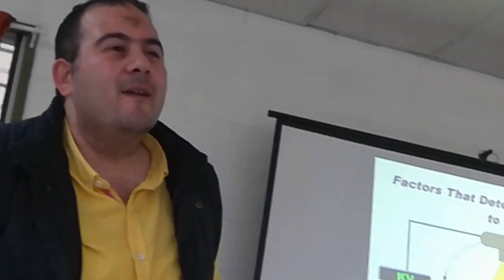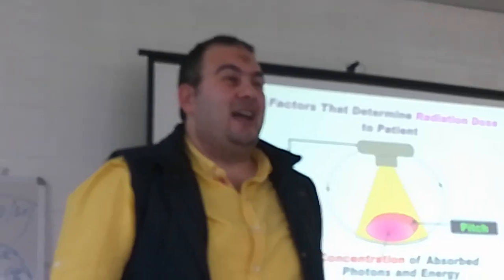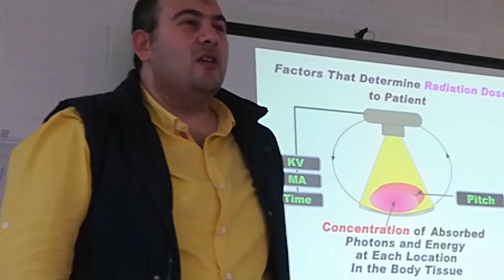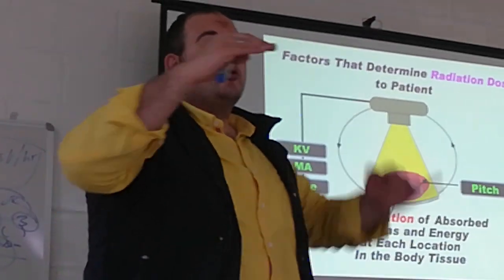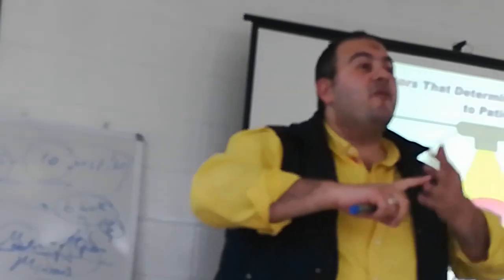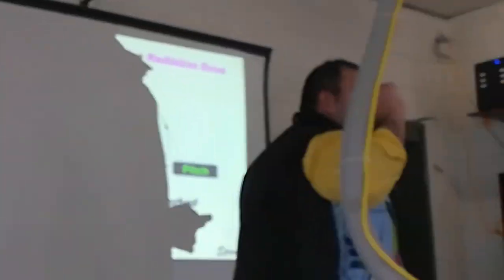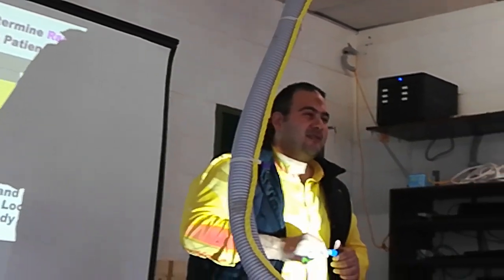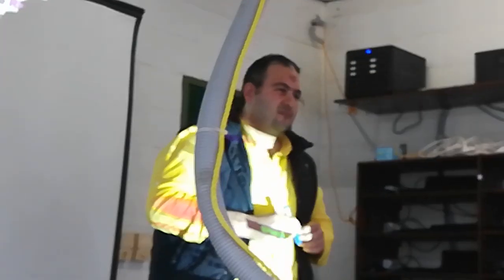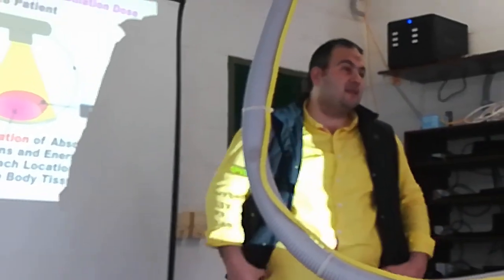Second question: you always do a scanogram before you do the CT. Yes. The scanogram is very low dose, and high pitch. The scanogram is useful first to determine the start and the end of the patient. Second, for dose modulation. I will discuss later how the scanogram is very important for dose modulation. Third, it gives us practically a normal X-ray of the chest. Sometimes you see more things on the scanogram, especially if you want to measure the length of bones or anteversion angles, like that.